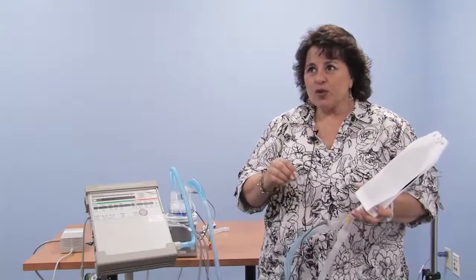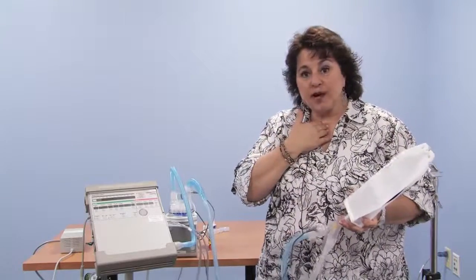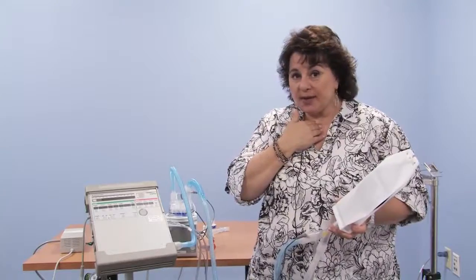This is probably the most common situation in which I receive calls from families that either they're getting an apnea alarm or the child's breathing fast at night and they don't understand it. So water in the hoses, potentially an air leak from the tracheostomy tube cuff being down or not being present, too much of a leak. So we can work together to resolve these issues. We can talk about a different tracheostomy tube, one perhaps with a balloon. We can talk about a little more water or air to help resolve these issues.